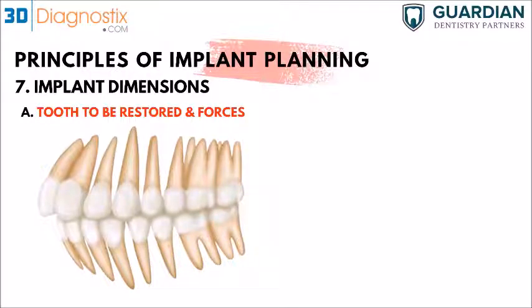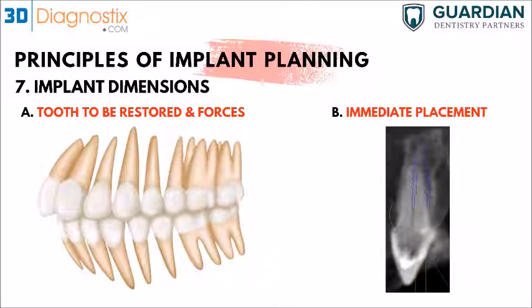And if I'm placing an implant at, for example, site number 10 or 7, where the mesiodistal restorative space is not that much and the forces are not going to be that much, then I can use a 3.0 or a smaller implant. So it does depend on the implant site and the forces falling on that tooth to be restored. Another thing that will help you decide whether you want to place a long implant or not is immediate placement. We see a lot of procedures where you take out a tooth, curette the socket, and then place an implant immediately.